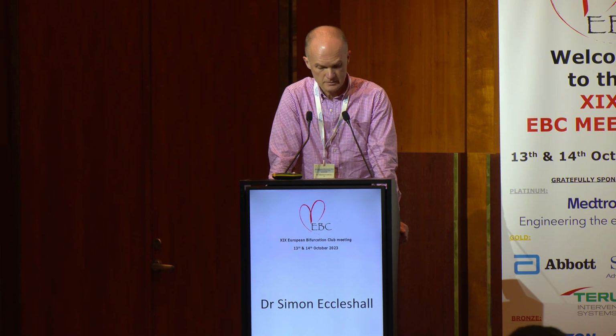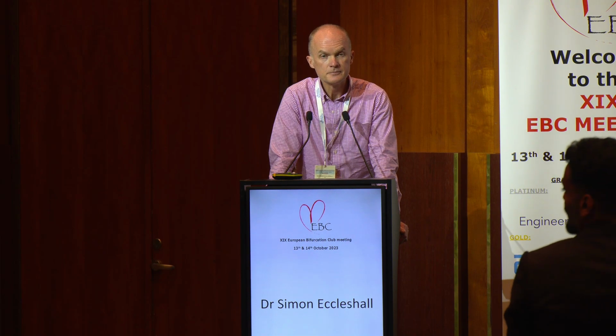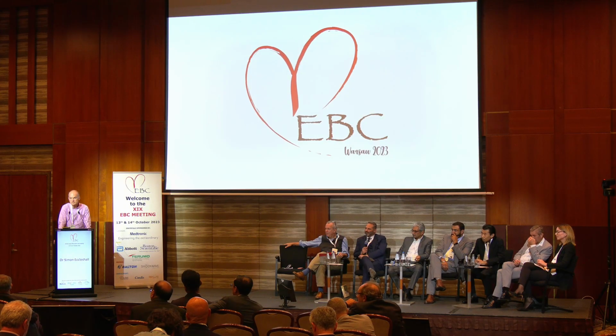Is this just historical? You just don't balloon the left main and leave it alone? We do, and there are published series now showing safe results. Most interventionalists will not do it. The last case that you showed, the clear-cut spiral dissection from the ostium of the LAD, and it stopped at the bifurcation. So, I mean, the gentleman said that patient is doing well. I think most of us would stent it.